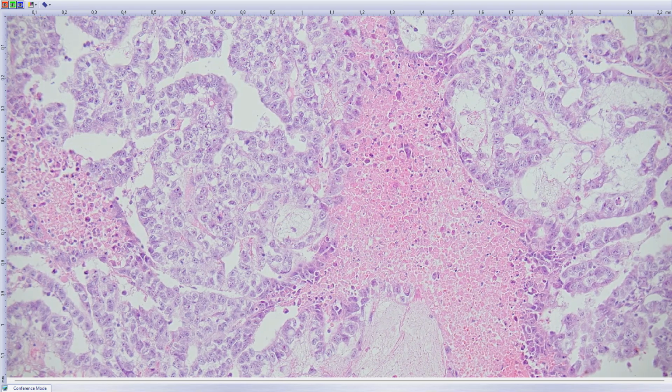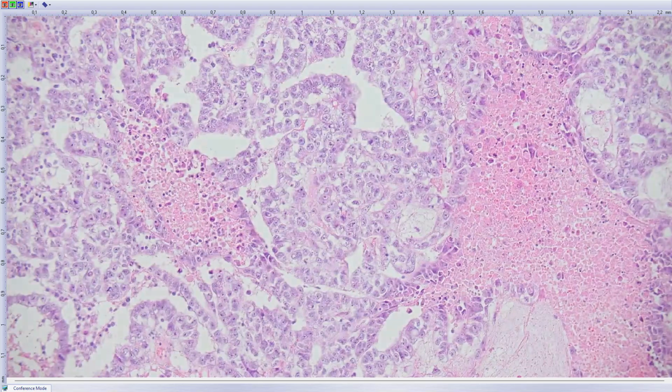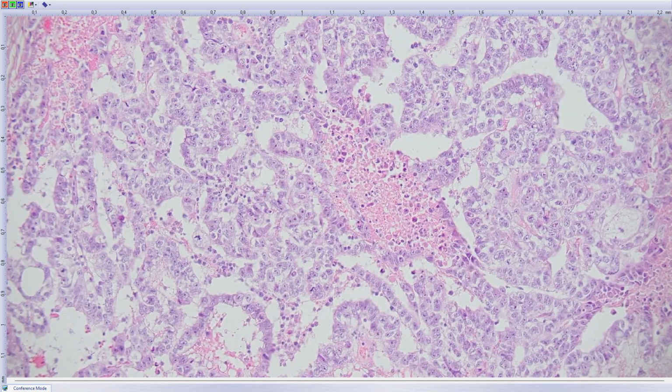So this is why the patient has got recurrence, because mixed germ cell tumors are treated by different chemotherapy protocols when compared to classical seminoma. And again, metastatic disease in 6 months is not what is expected for classical seminoma. I think that is the yolk sac tumor.